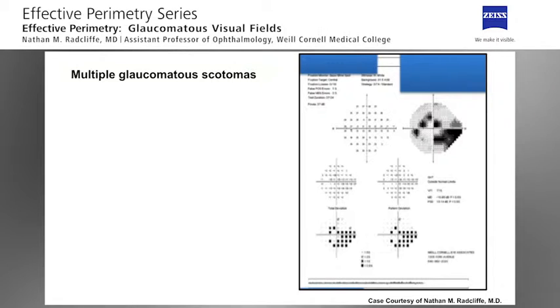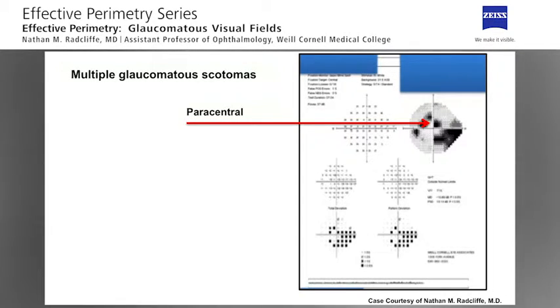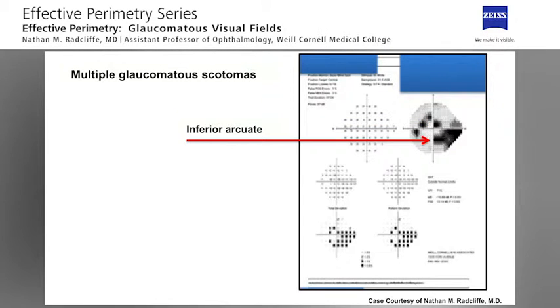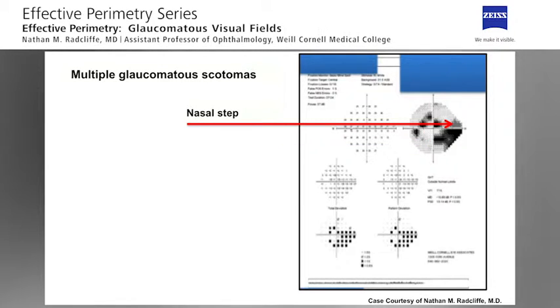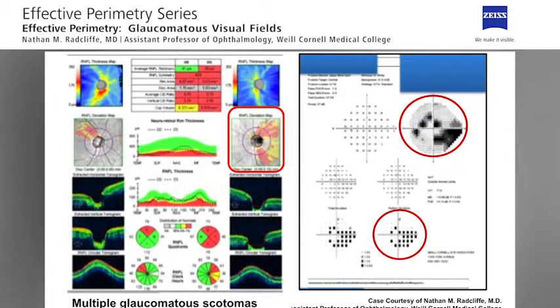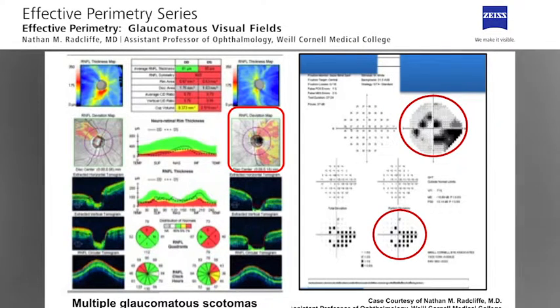This visual field demonstrates several classic glaucomatous visual field defects, all in the same eye. Superiorly we see a small paracentral scotoma, which is indeed an arcuate scotoma coming back to the blind spot. Inferiorly there is a broad inferior arcuate scotoma, and superiorly we also see a small nasal step. On examination of the Cirrus OCT, we see both inferior and superior retinal nerve fiber layer defects, which are both focal and diffuse, and which correspond to the visual field loss.